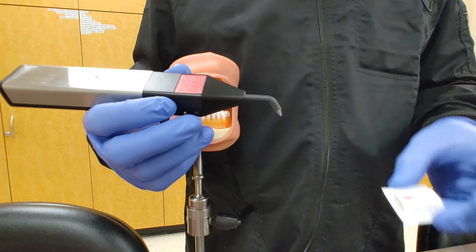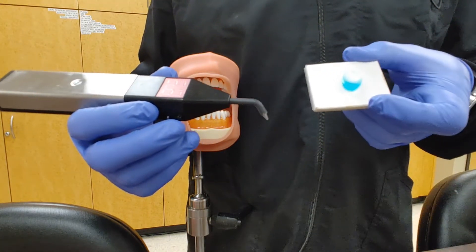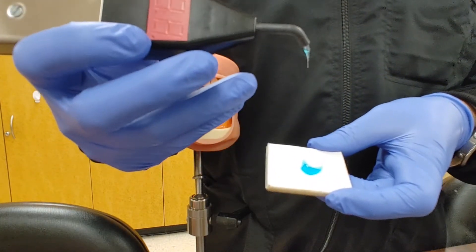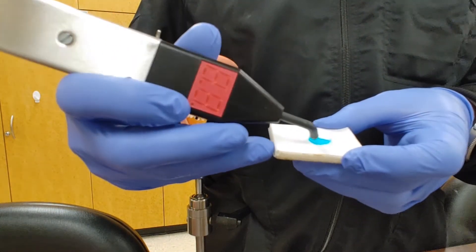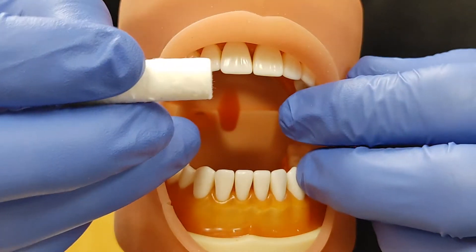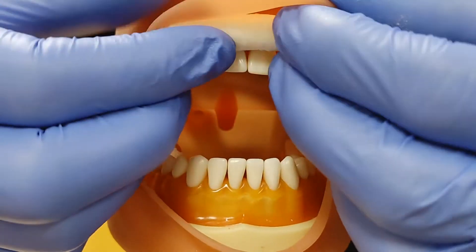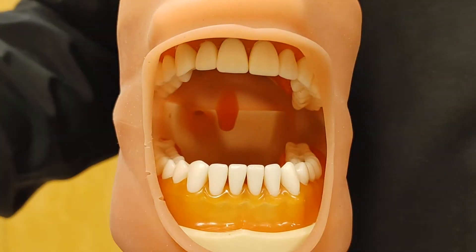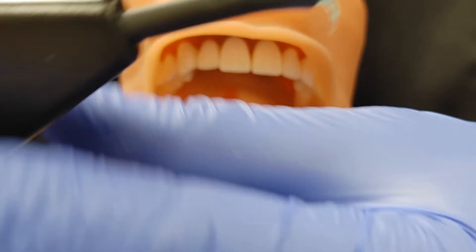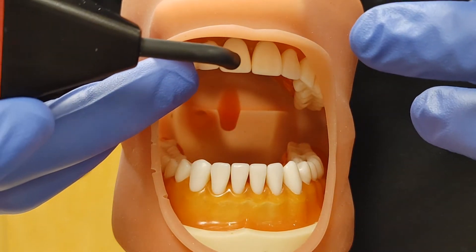Use some type of conduit such as a gel like fluoride gel or toothpaste on a mixing pad, and dip the tip into the toothpaste. This helps deliver the shock to the tooth. When prepping to do the shock test, make sure to dry the tooth and the neighboring teeth around it so that the shock doesn't deliver to multiple teeth at a time. Place a cotton roll to isolate the tooth from the lip. Then take the probe with toothpaste and place it directly on the center of the tooth.